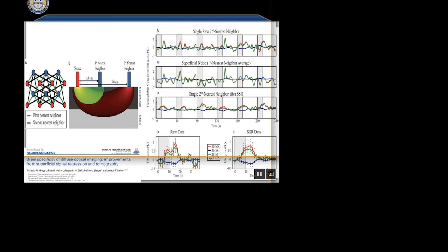Well, that's the other thing with the Arduino that I was going to suggest. Whether it's Raspberry Pi or Arduino, I don't know which one it is. It doesn't make any difference. But either way, you can attach sensors. You could then have on the inside of the cap like four heads, like a little surface temperature sensor, to know what the temperature of the subject's skin is, and how that's changing over time.